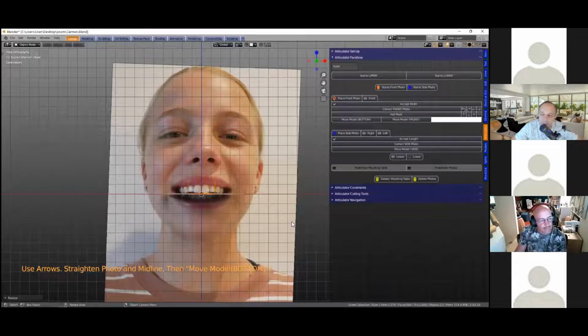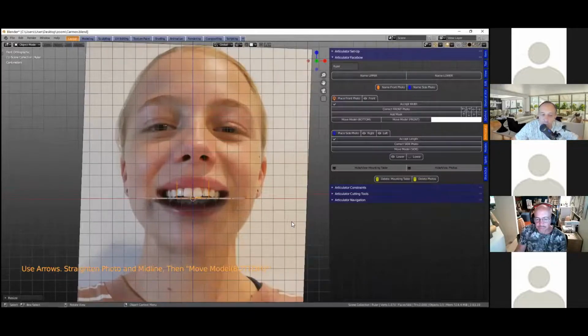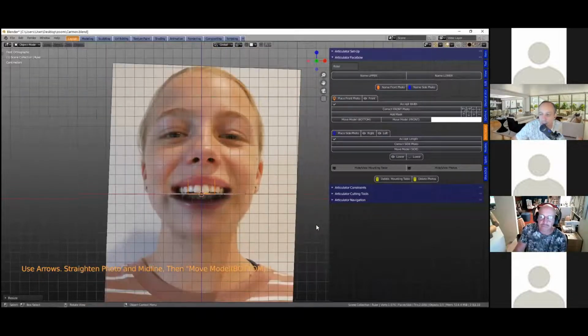The objective here is, firstly, to find the midline of the patient's face. The midline is the objective here. And of course, we know the pupils are on the horizontal with everybody. So in the previous version, we matched it to both the pupils, but now we're using the whole grid, and we've got another mask template that Michael will show now.